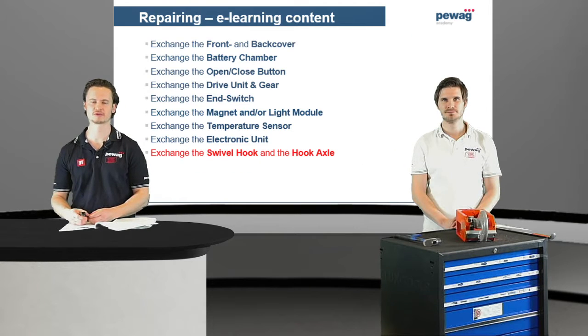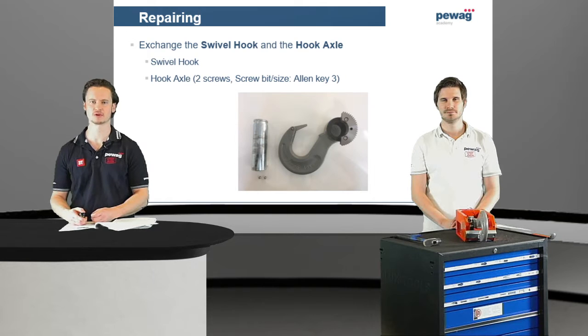This e-learning course refers to the repairing of the Levo hook. In this chapter you will learn how to exchange the swivel hook and the hook axle. To exchange the swivel hook and the hook axle you need a hammer and the Allen key size 3. Now our technician will demonstrate how to exchange the swivel hook and the hook axle.